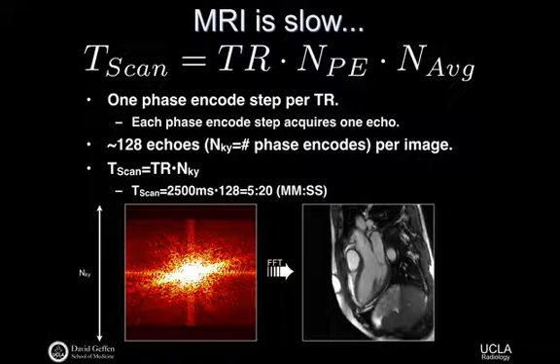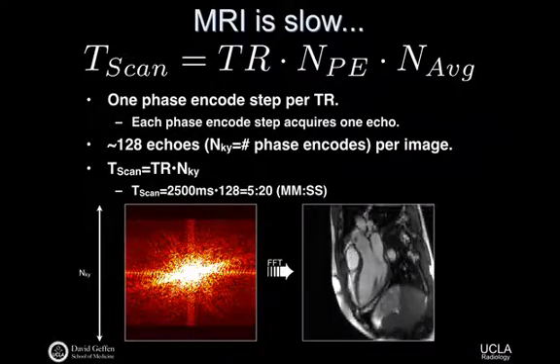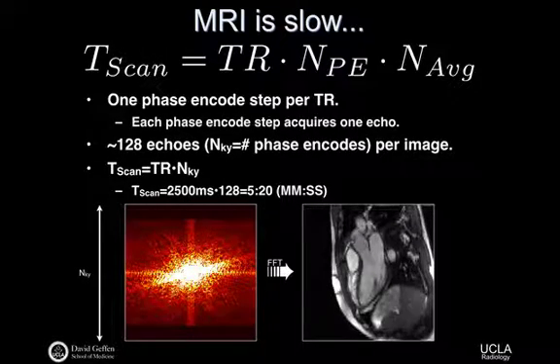acquire this data. So you go back to the 80s and the 90s, and you read MR papers, and they say, we acquire a spin echo image in the head in 12 minutes. And you go, it's hard to believe they could do anything, that they would get funded to do this. But at the time it was so remarkable that the field kept pushing, and then physicians said, okay, you guys got to keep working. Not acceptable.